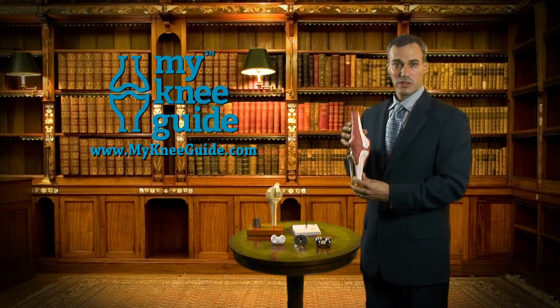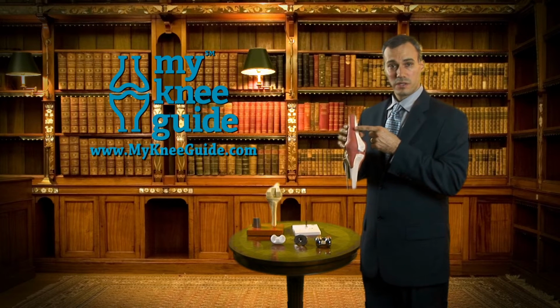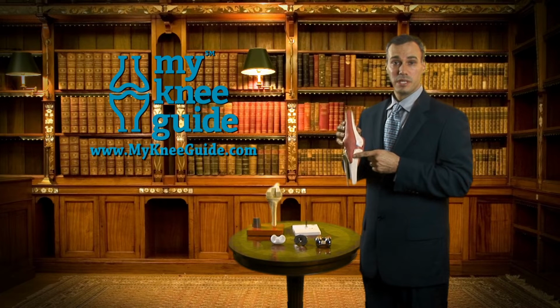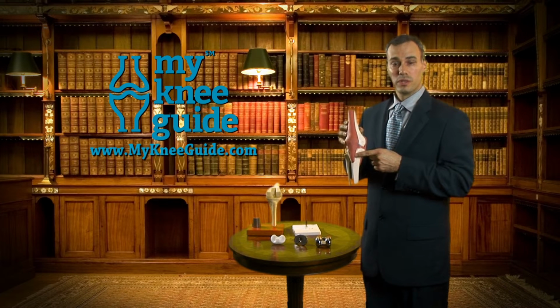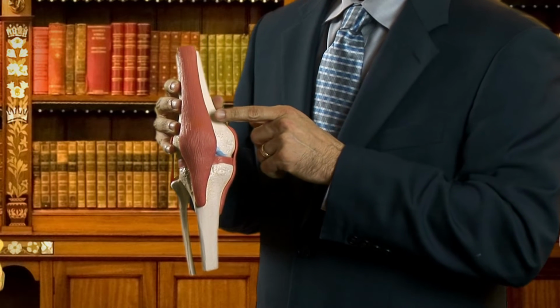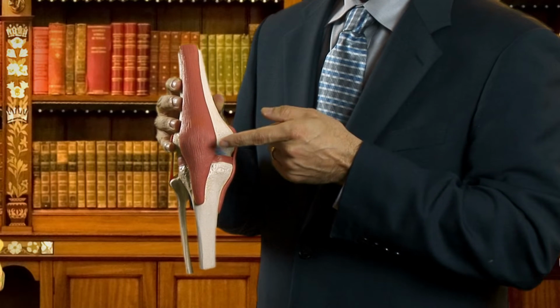He or she will dissect through the soft tissues to get to the extensor mechanism. The extensor mechanism consists of the quadriceps tendon, the patella or kneecap, and the patella tendon. The surgeon will then make an incision along the inner aspect of the extensor mechanism. Traditionally, this incision is brought up along the edge of the quadriceps tendon.